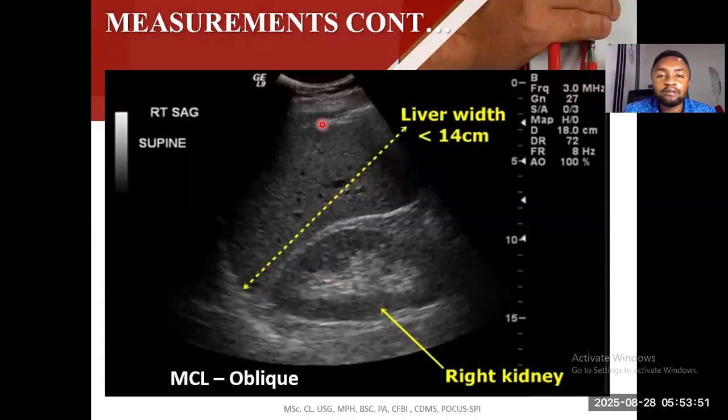Eric, can you come again? Okay, somebody. Renal sinus. Okay. Yes, I think Isa too has written it here. That's the sinus. All right. That's good. Yes, that's the echogenic part of the kidneys. That's the sinus. But we are not there yet. Don't worry. When we get there, we will do the anatomy and the physiology of it before we move to the ultrasound. Okay. So this is how the liver is measured.